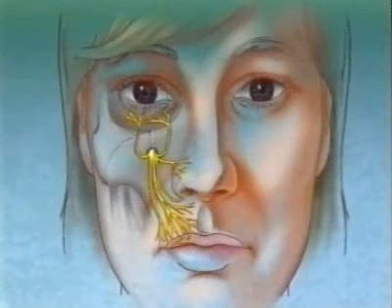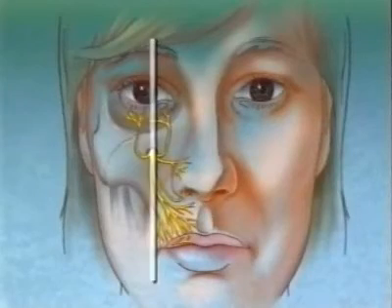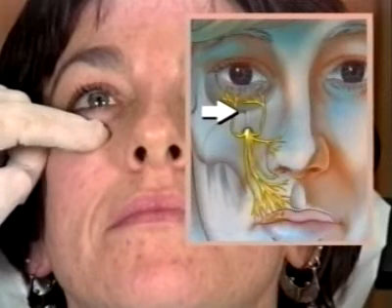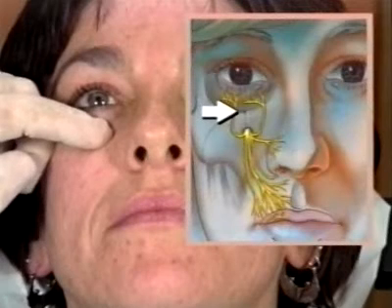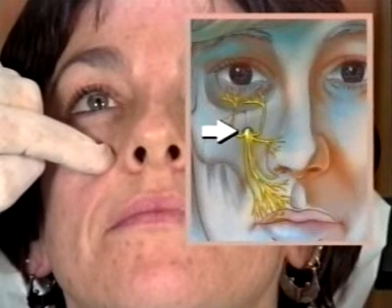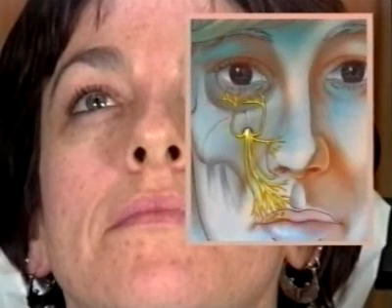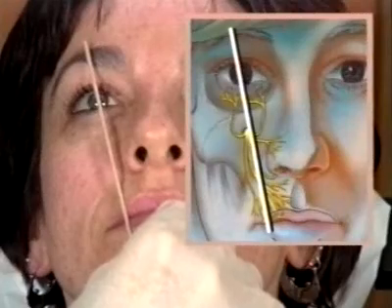Before injection, it is important to locate the infraorbital foramen. When the patient is looking straight ahead, a line drawn vertically from the medial aspect of the pupil will overlie the foramen. The foramen is identified by palpating the infraorbital rim and feeling a notch or roughness corresponding to the zygomaticomaxillary suture. Then, sliding the finger inferiorly 5 to 10 millimeters will bring it to rest in a depression containing the infraorbital foramen. Anatomically, the pupil, infraorbital notch, and infraorbital foramen lie in a straight line.